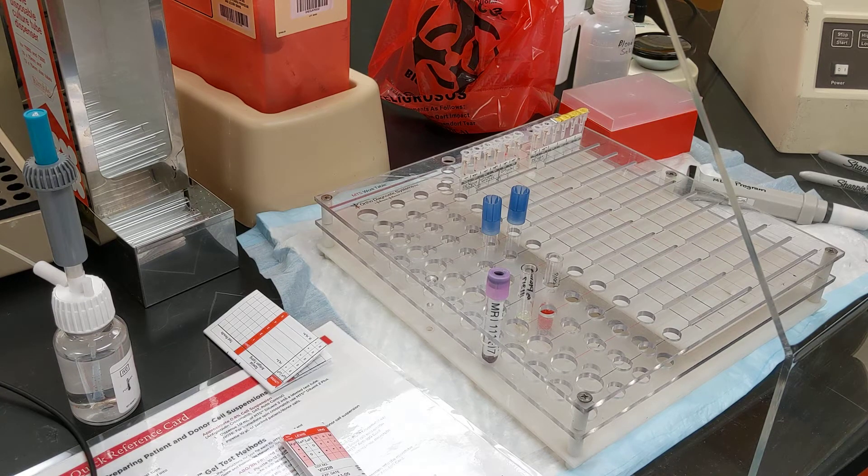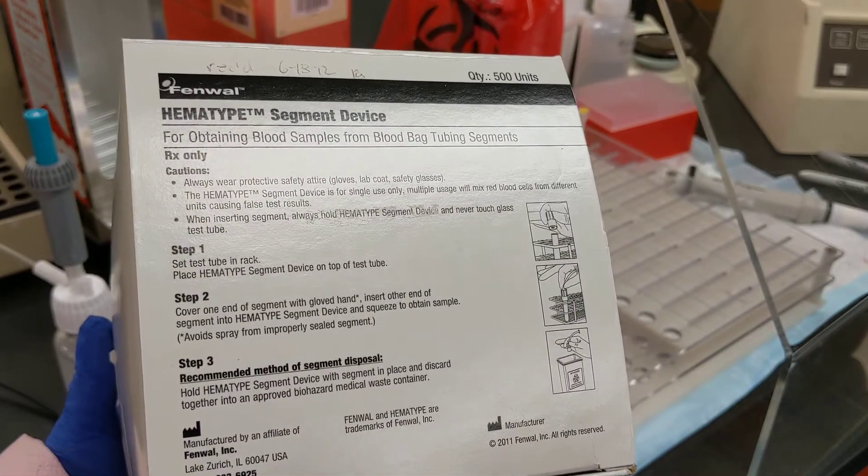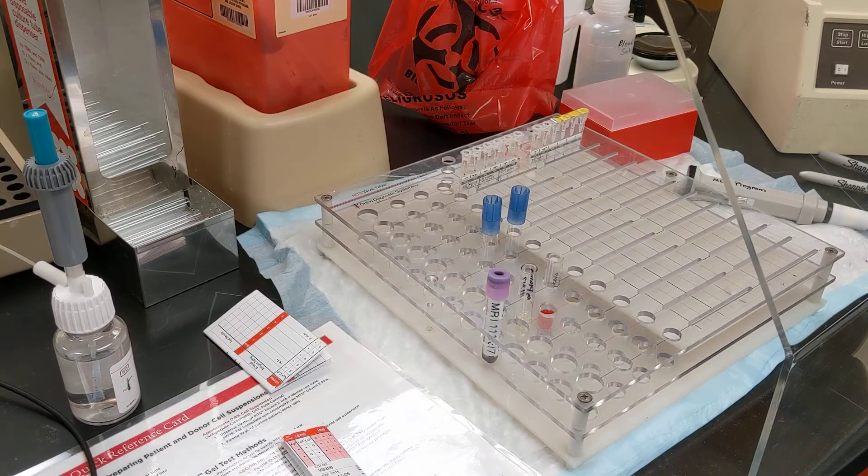Welcome to the Akron Cooperative Medical Laboratory Science Programs video series for Blood Bank. Now we're going to talk about how to use the hemotype segment piercing device, which is the blue thing that's sitting on top of the tubes in the rack.